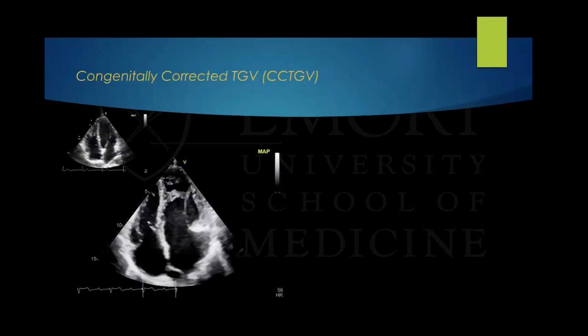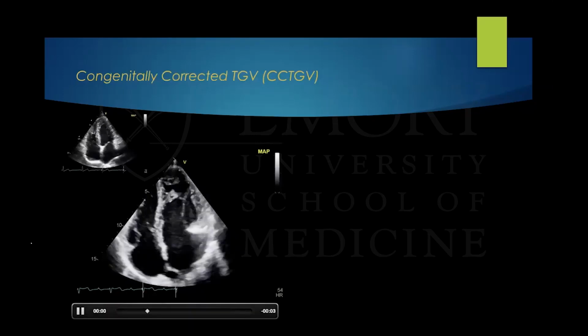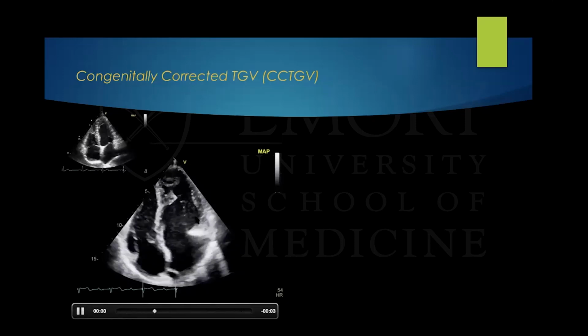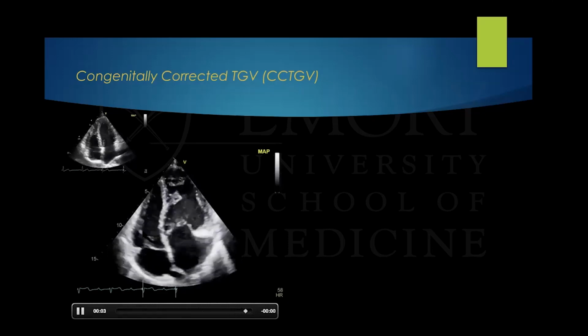And in the 4-chamber view, you have the normal on top of the screen. You will encounter that the right ventricle is to the right of the screen, and the left ventricle is to the left.